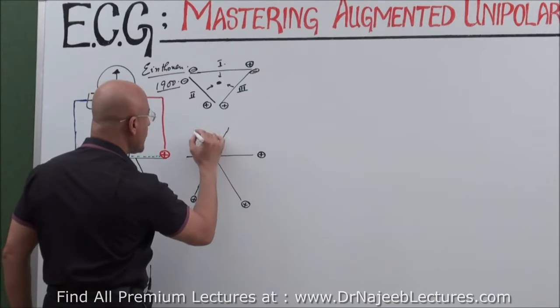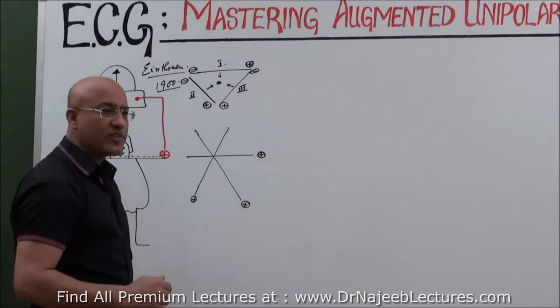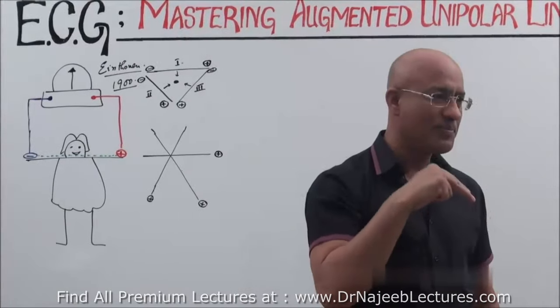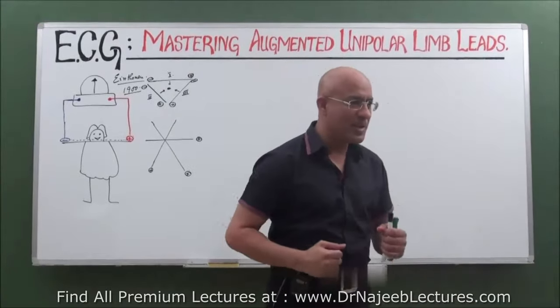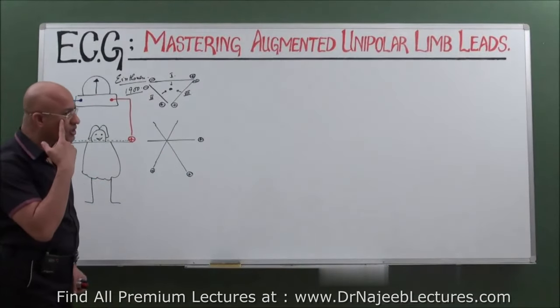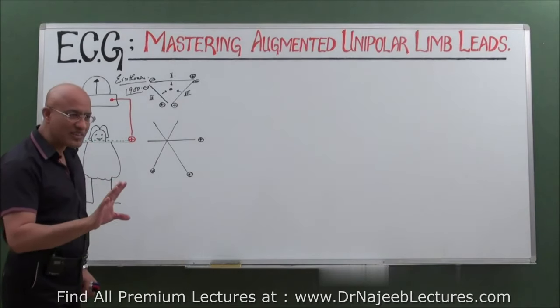Right? Now you imagine, I told you the electrical activity of the heart is just like a beautiful hot girl walking when depolarization is moving in the myocardium. And I told you that these positive electrodes are the eyes of the naughty boys looking at that hot sexy girl. Yes. Is that right?